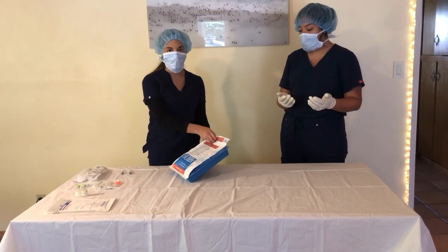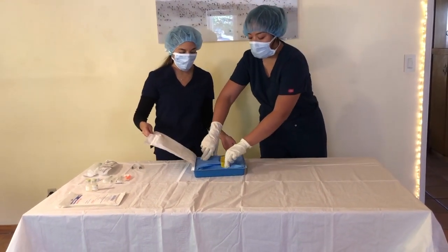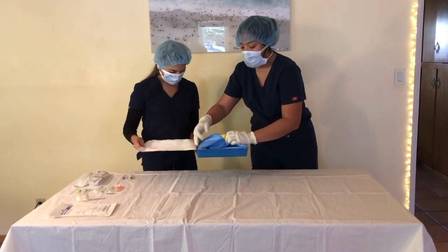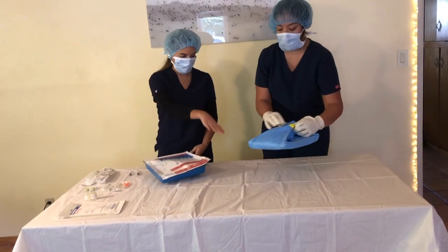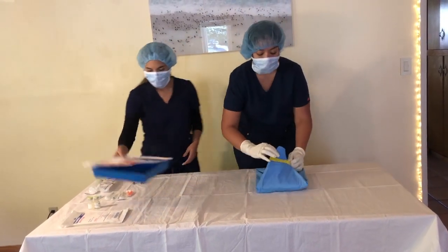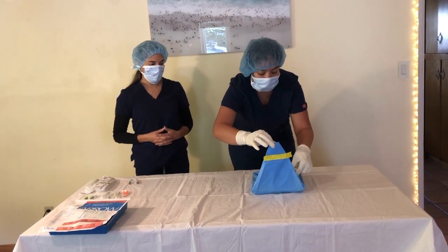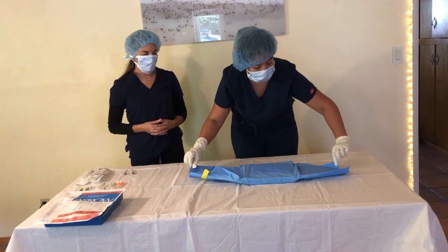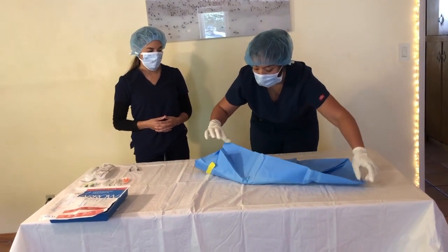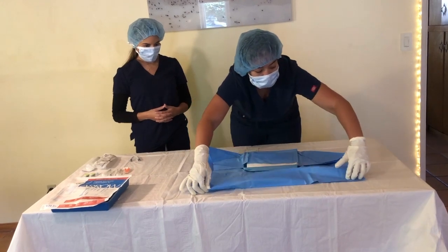You wanna open up the sterile tray away from you, and she's gonna go ahead and grab it with both hands and put it onto the sterile field table. Okay, so now I'm just gonna open this up. I wanna make sure I'm only touching the edges. And what I'm gonna do is get the tray ready for the doctor.